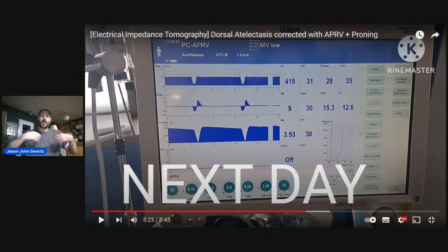And like I said, the patient wasn't on ACVC, so I got the patient just on pressure control. When I saw the PEEP was 8 and the pressure control was 32, and we were getting around 312 tidal volume on ACPC. So she's actually small. That's around 6 cc's per kilogram, which just shows it's like, okay, great. We're not using large tidal volumes, but yeah, the lung is like completely shut down.